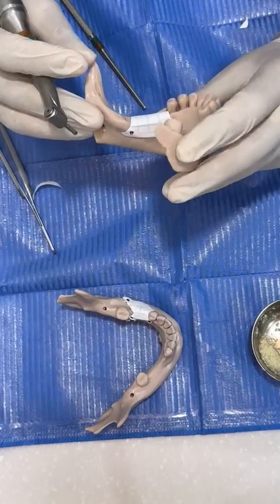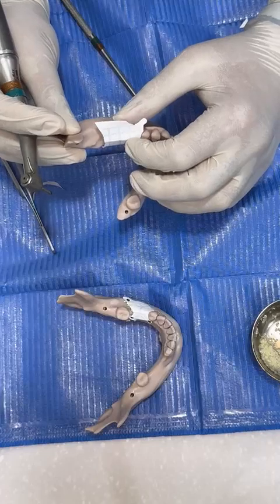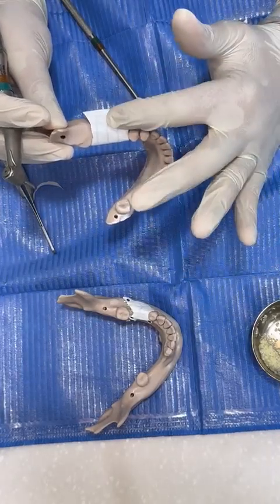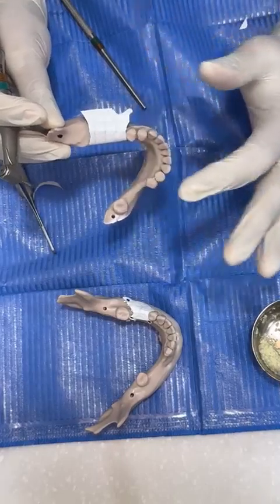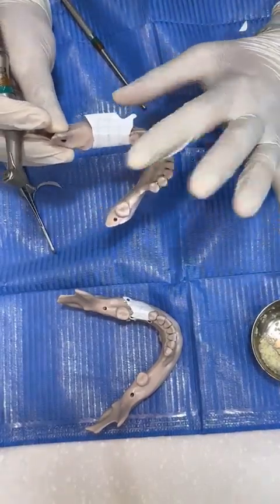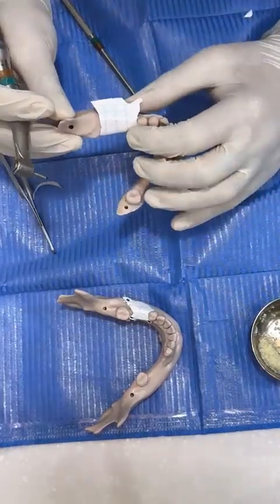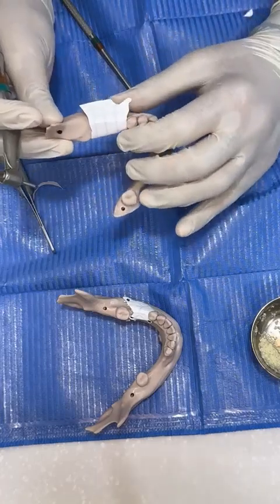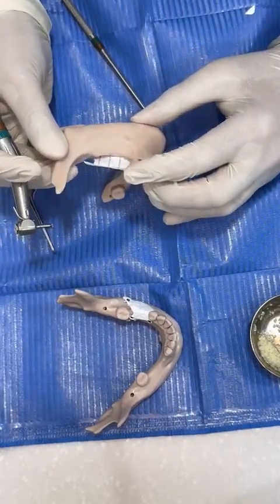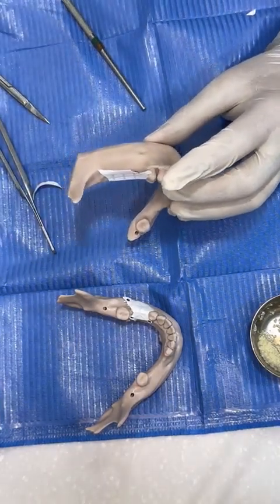Okay, now I can put graft from the labial side. I raise the membrane from here, make sure it's away from the saliva. I put gauze between the lingual flap and the membrane. My assistant is taking care of no contamination with saliva. This is your enemy during the surgery. Any contamination, even if you cannot detect it with your eyes, can later on affect the healing process. So we can raise the membrane like this, and now we have the space to put the graft. And I will ask my assistant now to put the graft below the membrane.